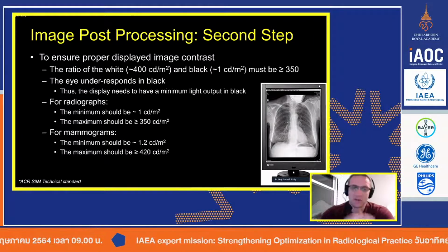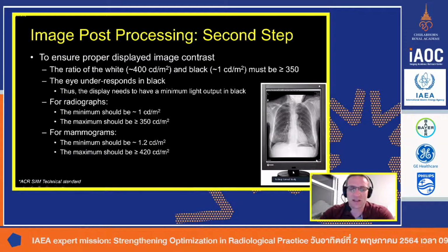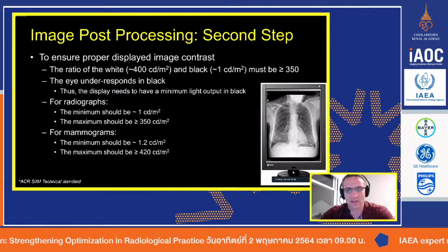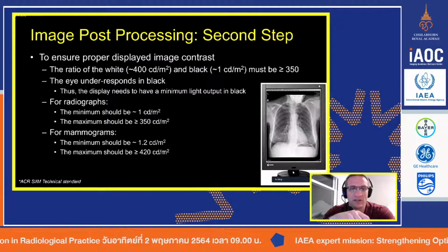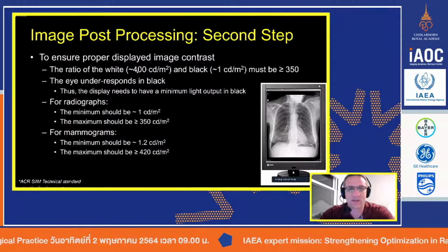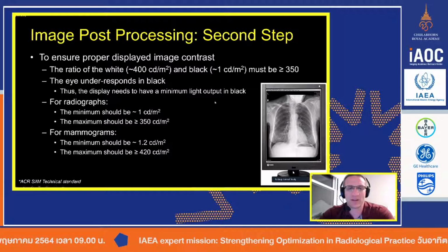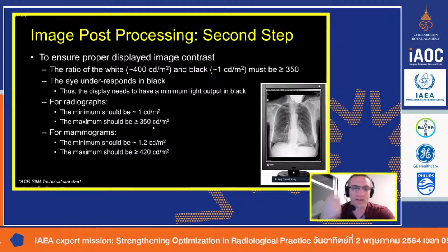a light bulb. And so if a radiologist ever comes to me and says, I have a headache every day after I've looked at these monitors all day, I can almost always go in and see that it's out of calibration. It's almost always set at 500 or 600. And so radiologists will be the first to tell me they complain if it's too bright. So that's why we usually set it at 400 for their comfort level for their eyes.